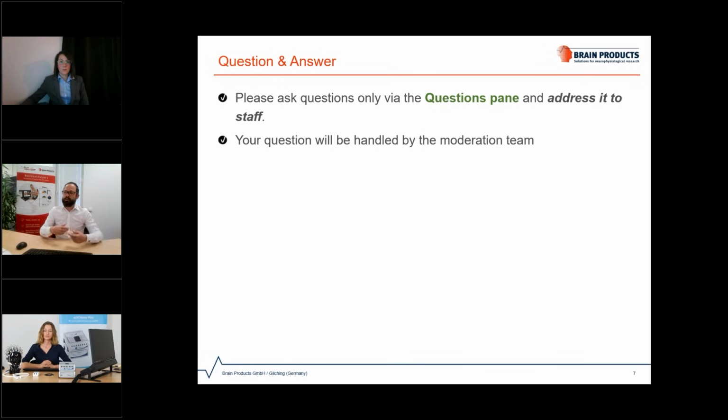Then I'm sure that my trials are really just based on the first fixation. This is just one example, but basically whatever markers you import from the eye tracker, you can make use of in Analyzer, and markers can always be piped into the segmentation.